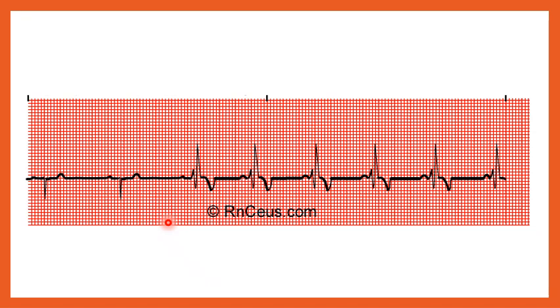Okay, most of the time this patient's in a sinus rhythm, yes? Sinus rhythm. And then it looks like the patient's heart rate speeds up a little bit, not a ton, but if you were to take your calipers, you can just eyeball it. It doesn't take calipers to show you, but you can go from here to here, measure that out, and notice when you bring your calipers over, this beat comes in early. Still, all along the way, the patient is still in sinus rhythm.